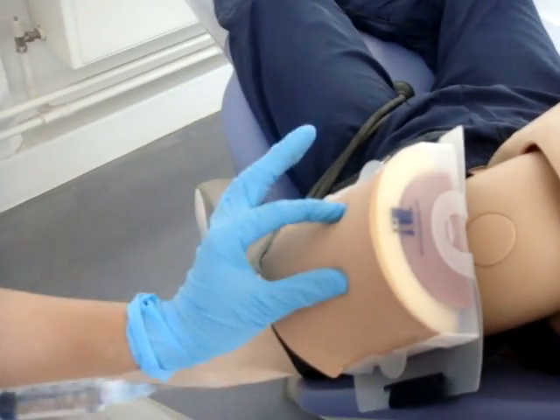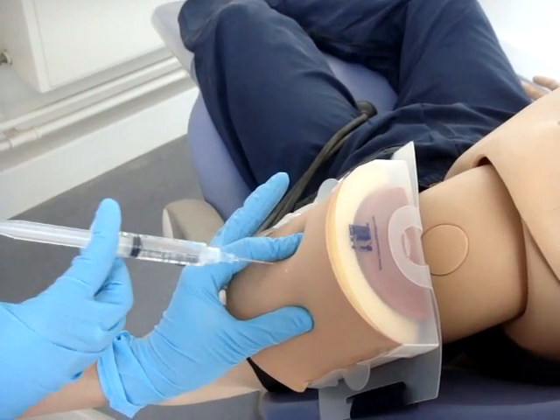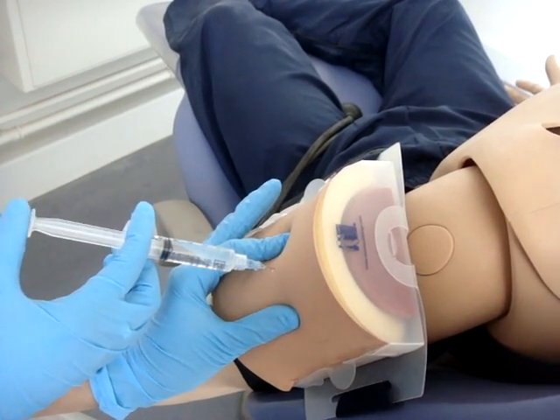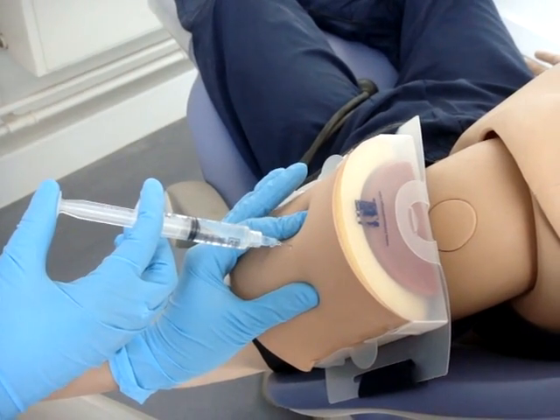Squeeze or stretch the skin — this helps tighten the muscle. Insert the needle two thirds into the muscle. Aspirate to ensure it's not in a blood vessel. Inject the solution slowly.